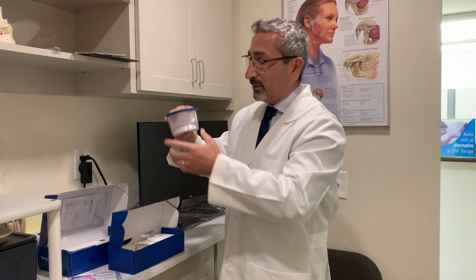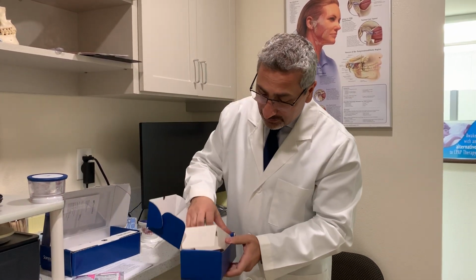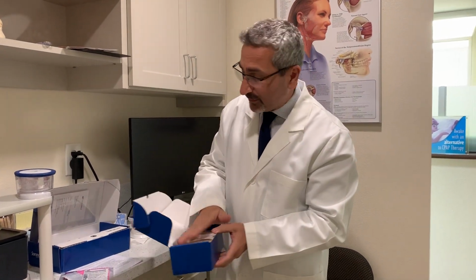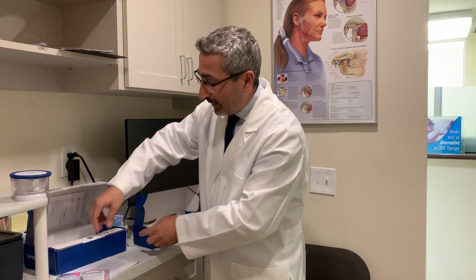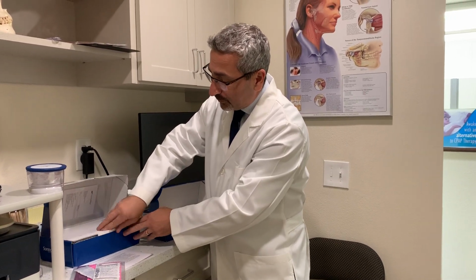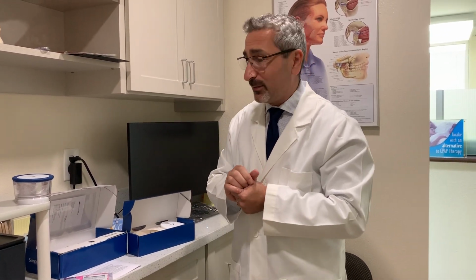As you take your box apart, you're going to take out the blue part, and then when you take that out, this is the mouthpiece. Underneath there are impressions in there. Those are the impressions we took in the beginning. And in the front part of this are the models. Those you need to keep for safekeeping, just in case if anything happens to your mouthpiece, we can send it back to Somnomed to get it repaired.